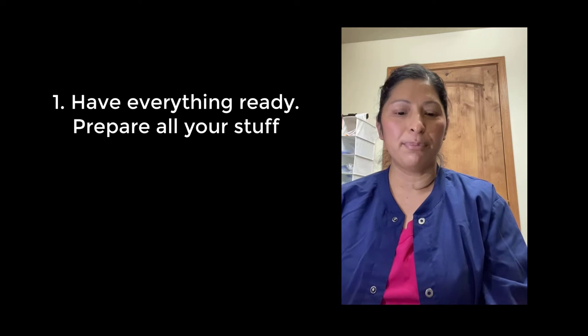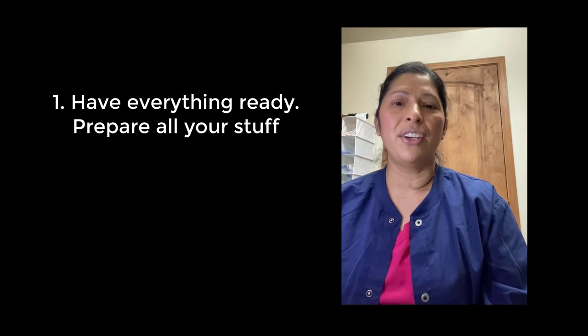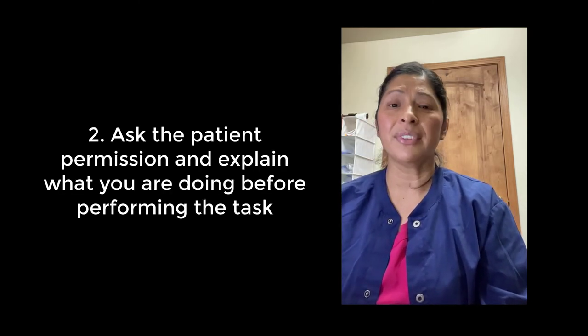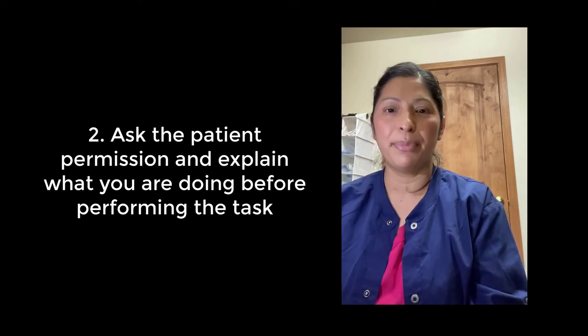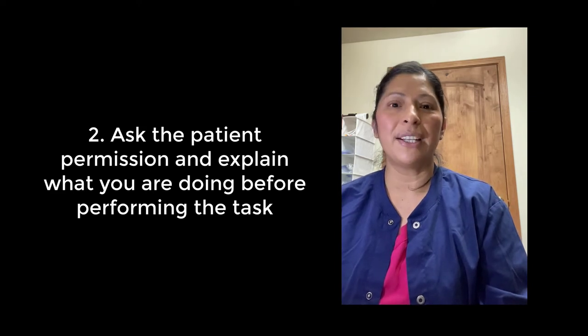Tip number one: always prepare all your stuff that you need. Mostly when you're working alone, you have to have all your equipment very close to you. Tip number two: always ask for permission from the person before you perform a task — especially when working with people with special needs who may not completely understand what we're going to do.